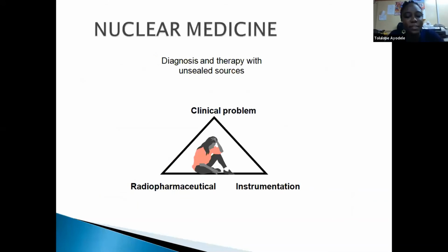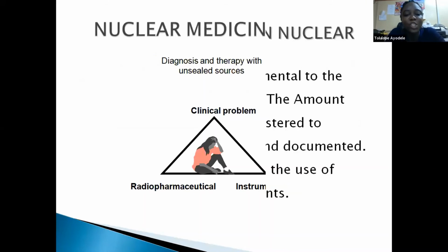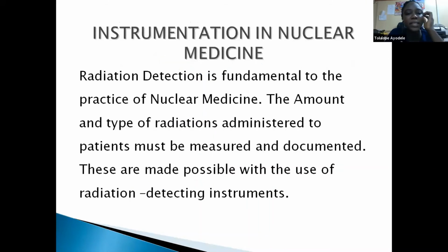In essence, this is a summary of what nuclear medicine is about. There's an indication for a problem, and we use an unsealed source termed a radiopharmaceutical. Once it has been injected or swallowed, it is detected by the detectors. So let's talk about the instrumentation in nuclear medicine.